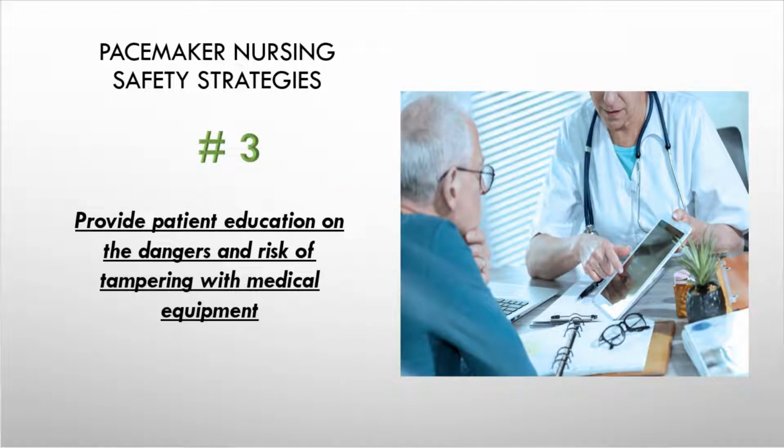Which brings us to the third one, which is the most important one: patient education and family education. Make sure that you let the family and the patient know about the rationale for not touching the pacemaker, the need for the pacemaker, why they have it, and also to tell you if the patient starts to feel unwell, if they start to feel pain, or if they just start to feel unwell overall.